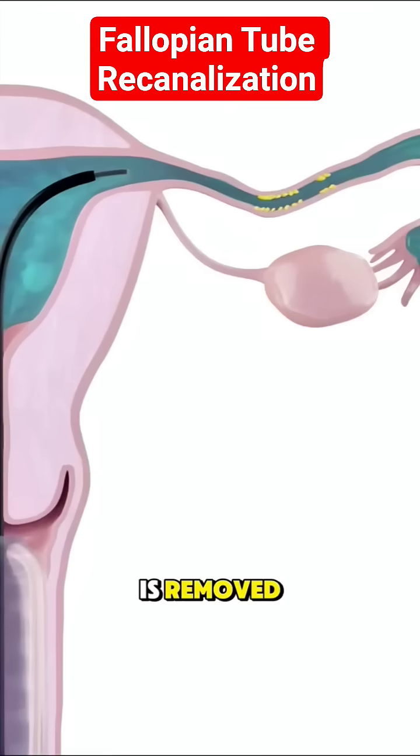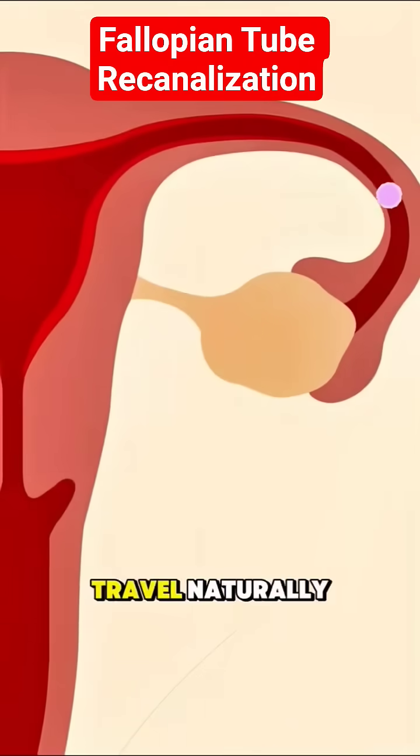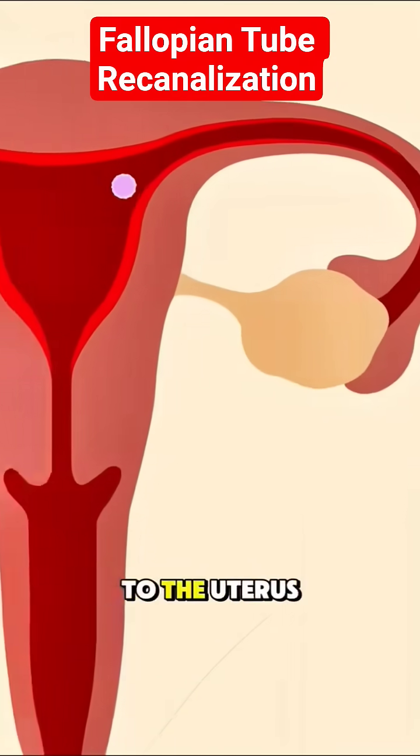Once the blockage is removed, the fallopian tube is open again, allowing eggs to travel naturally from the ovary to the uterus.